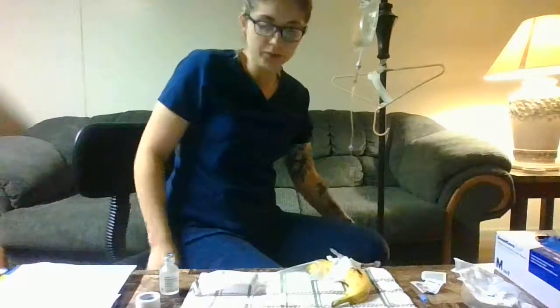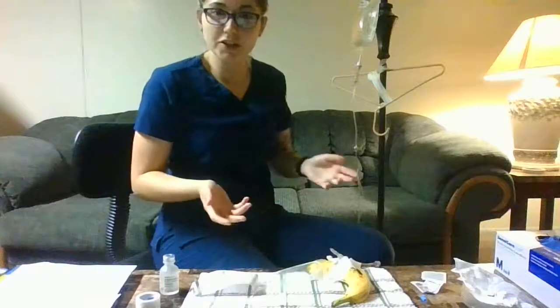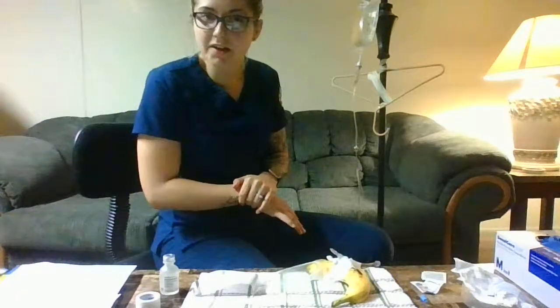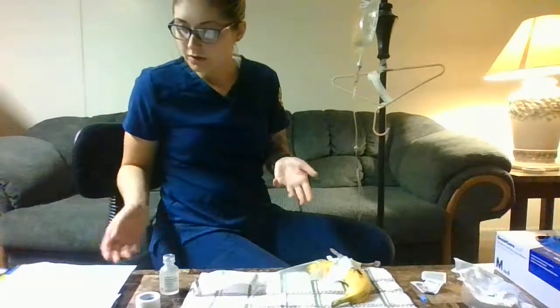And then before you leave, make sure the patient doesn't have any questions, check their IVs, make sure the tubing is fine, everything is dropping at the rate that it's supposed to. Patient safety, give them their call light, and then you're going to document that you administered that.